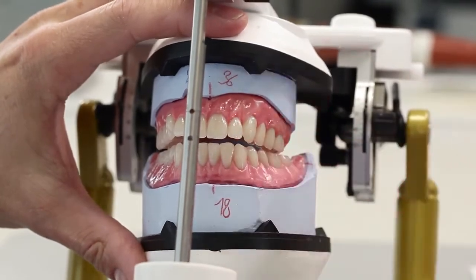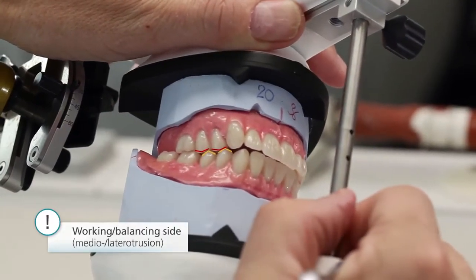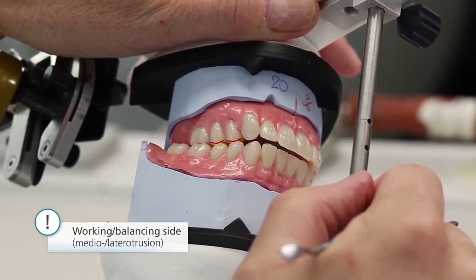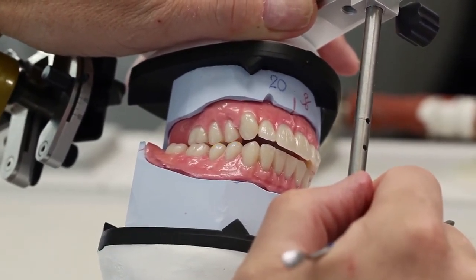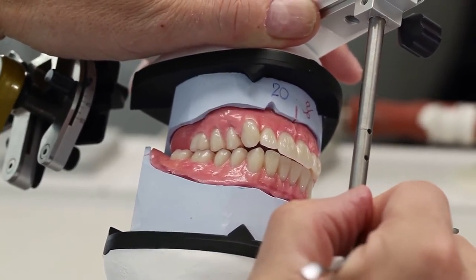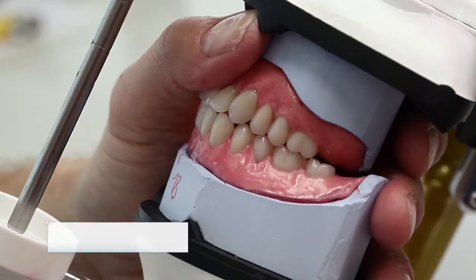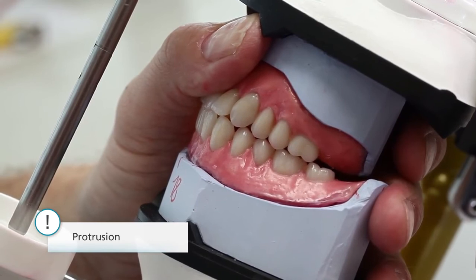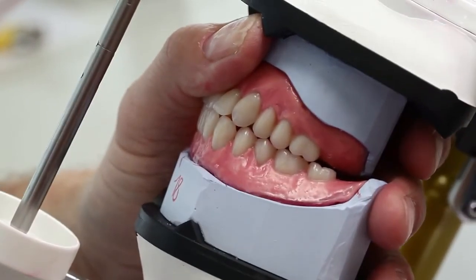Check whether the bucco-mesial surfaces of the upper premolars slide over the bucco-distal edges of the lower premolars on both sides. The mesiopalatal cusps of the upper molars slide on the disto-buccal cusps of the lower molars. The disto-buccal facets of the upper premolars slide over the mesio-buccal facets of the second premolar and the first molar.